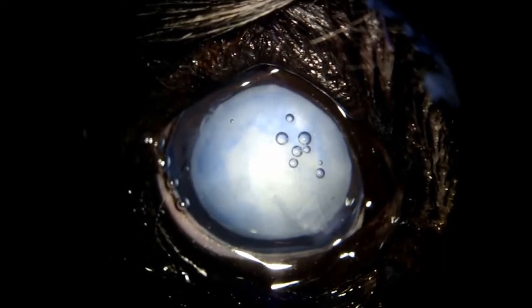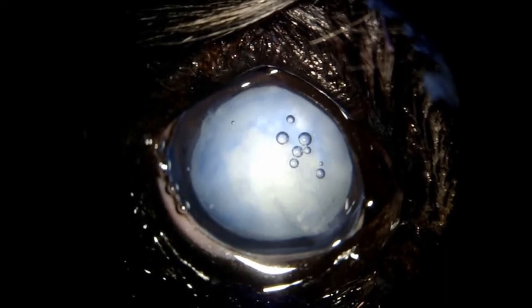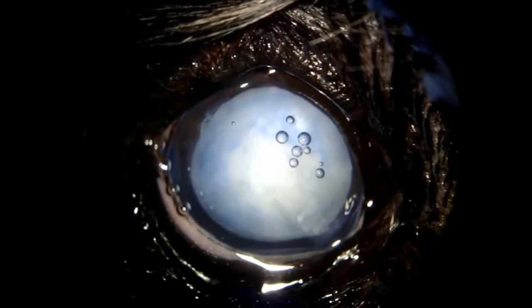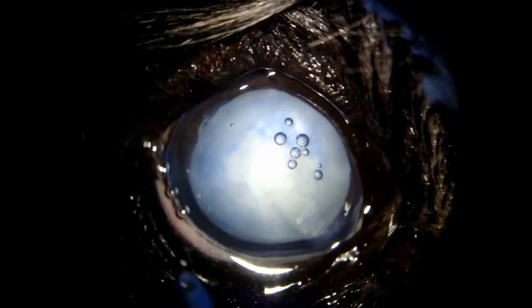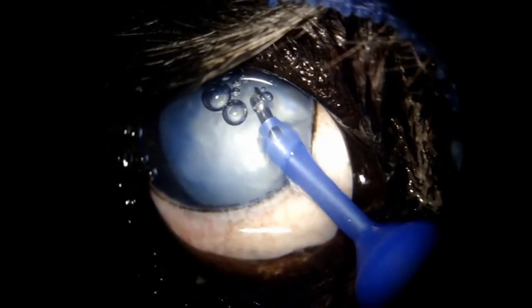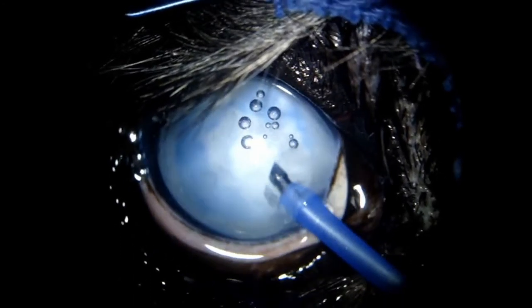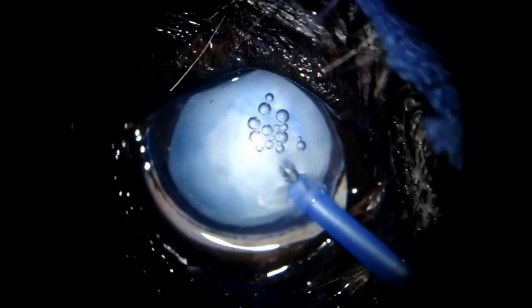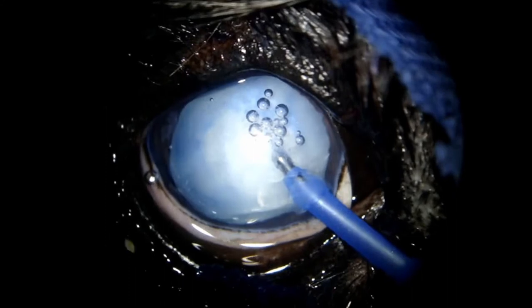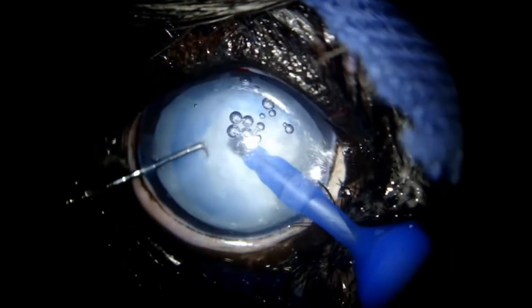So now we're ready to start the phacoemulsification. Just get the phaco handpiece here. So stage one, to enter the eye. This is that special phaco tip that I showed you guys in the beginning of the surgery. And in my left hand, I have a chopper. Just take this drape a little bit out of the way. So this is my chopper. And we start emulsifying the cataract.